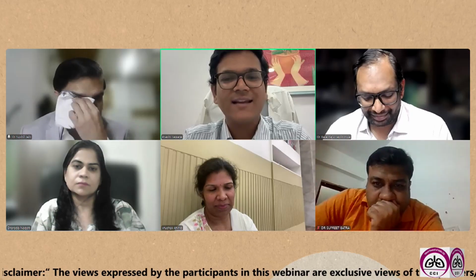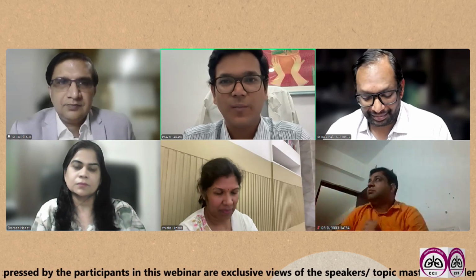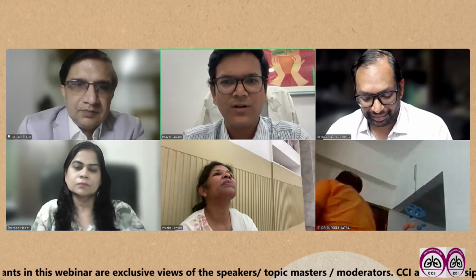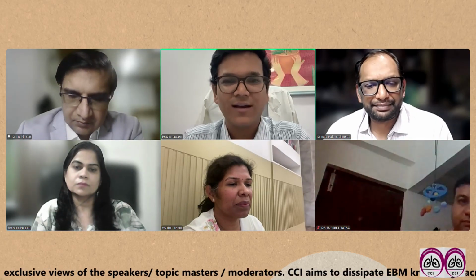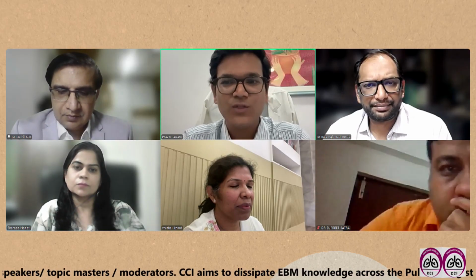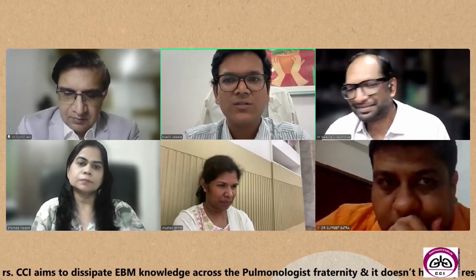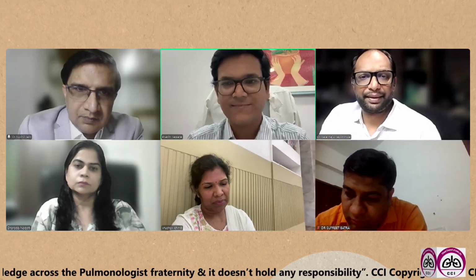So don't do that. Second, keep good coordination with your team, with your technicians, with your pathologist, or with your colleagues and juniors to improve the yield, and for the pre-procedure preparation and post-procedure monitoring, because post-procedure you are not there, your team is handling the patient. Third, again most important is preserving the extra sample. If you are struggling with the diagnosis, call up a pathologist or a microbiologist and tell them to preserve the sample if you need extra sampling for either molecular or some extra microbiological testing.